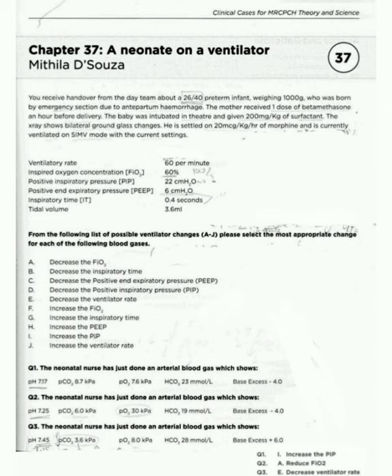So, that is low. If only the partial pressure of carbon dioxide is low, then, as in the previous image, we decrease the ventilator rate. So, in the third question, only the partial pressure of carbon dioxide is decreased, and according to the previous image, we decrease the ventilator rate. So, the answer to question number 3 is decrease the ventilator rate.